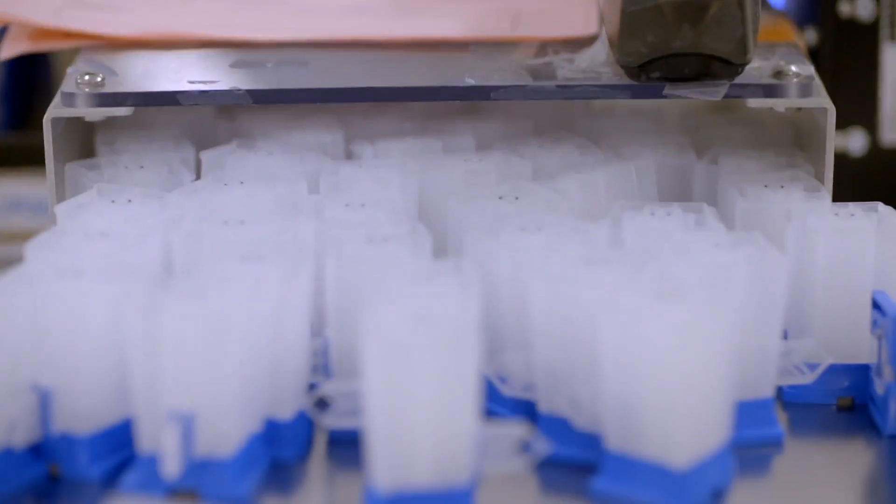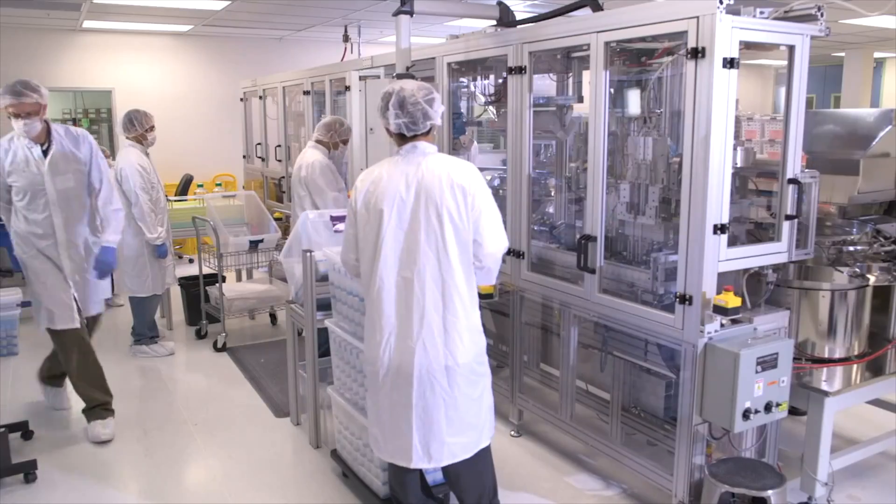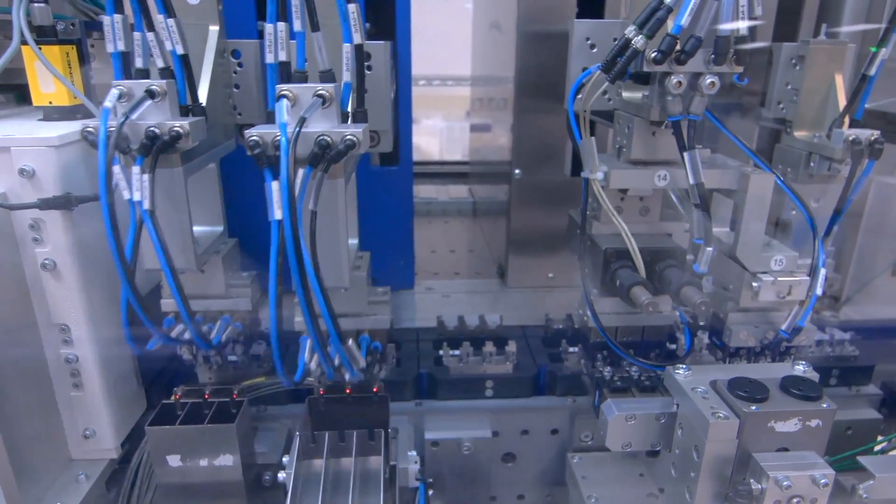The empty cartridge bodies are sent to our production facility in Sunnyvale, where they are filled on an automated line called ROBL, which stands for Reagents On Board Automated Line.